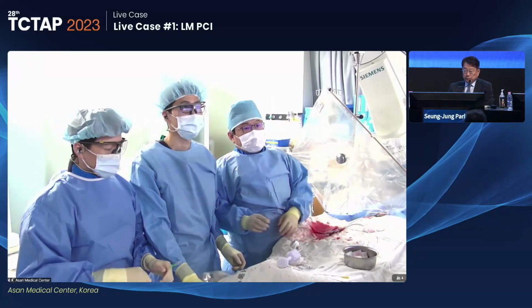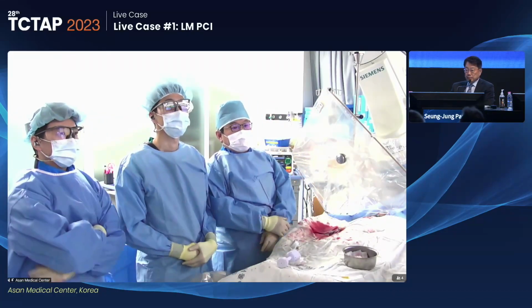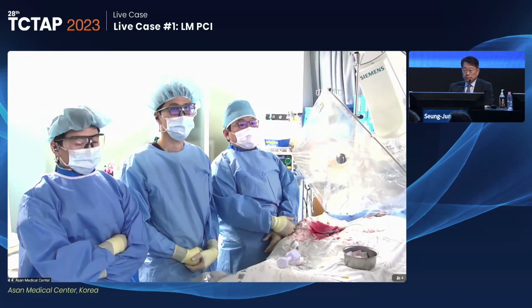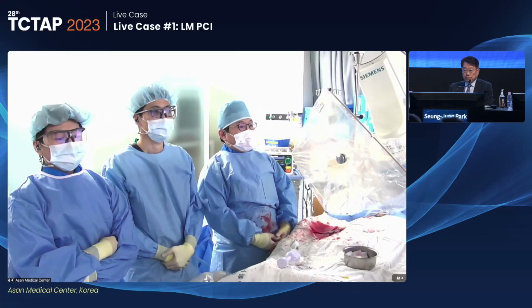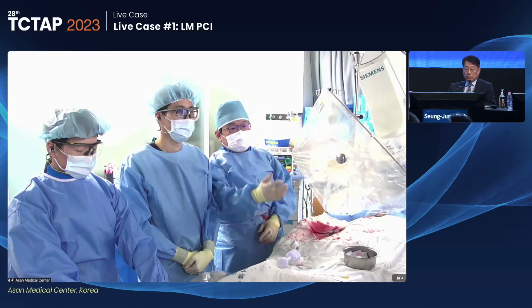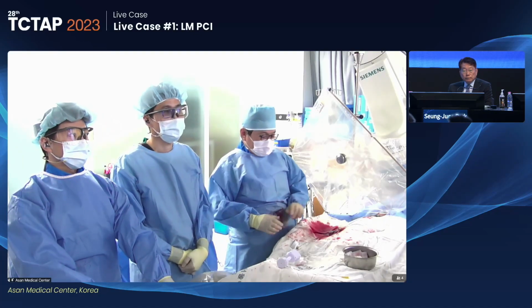I'd like to introduce my team. So this is Professor Cheol Lee from the Kang University. And then my senior fellow, Hyun Kim, will join our live demonstration. So, Professor Lee, could you introduce our first live demonstration patient?